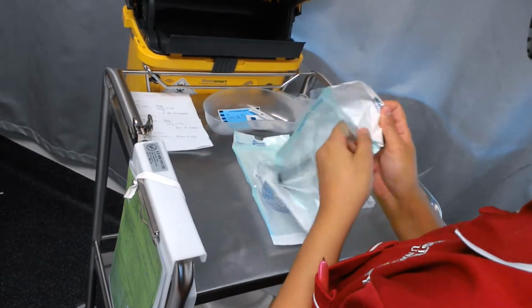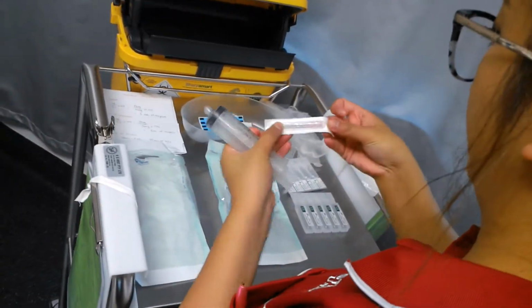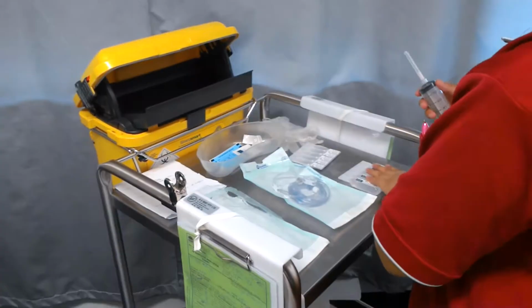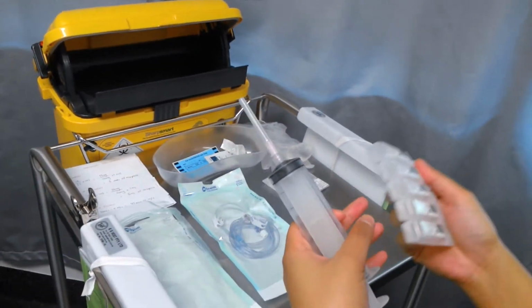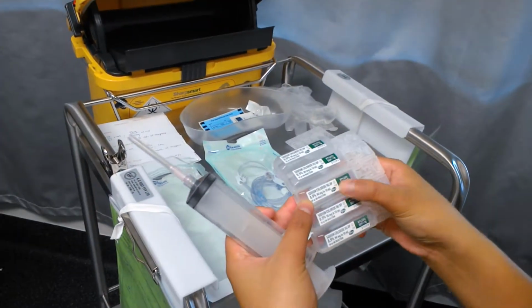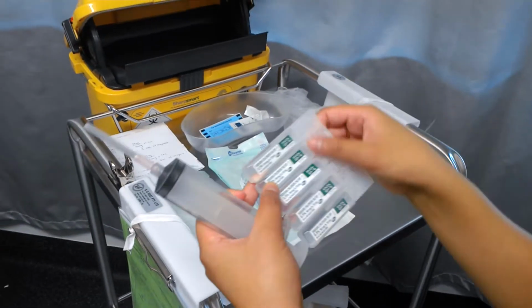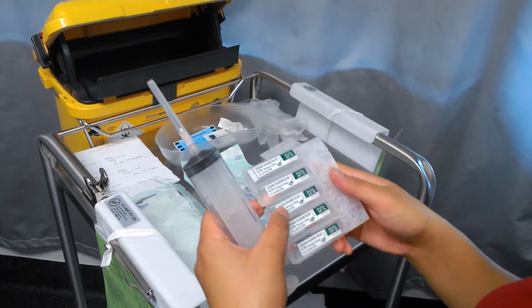Is the packaging of the syringe still intact? And same as with the drawing up needle. And since I know that I need to give a total of 50 mils to the patient, I've got normal saline here. So second nurse, can you please check the normal saline with me? So I've got sodium chloride in 10 mils, sodium chloride in 10 mils, sodium chloride in 10 mils, sodium chloride in 10 mils, sodium chloride in 10 mils, all with the same expiration date of September 2018. I've got 5. But I know that I only need to make up 45 mils of it because the other additional 5 would be of the morphine.